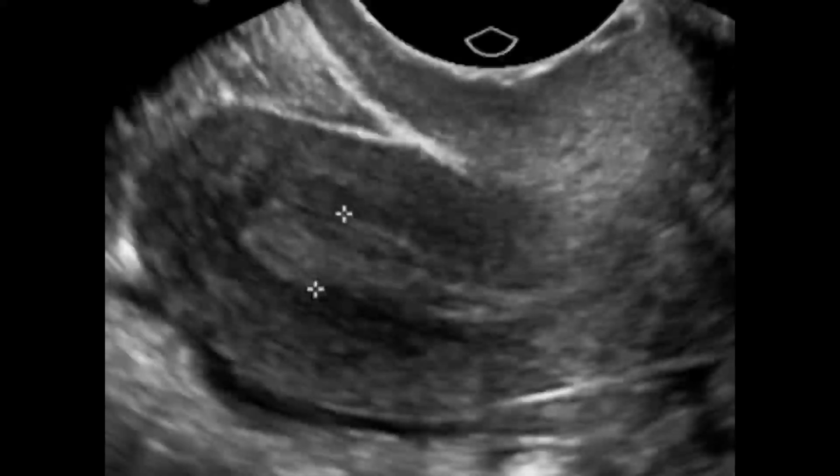This is a clear view of the transvaginal scan, and you can appreciate that the endometrium is thick. The myometrium is quite normal, endometrial thickening is there. You know that the endometrial thickness varies according to the phases. In the proliferative phase it should be between 5 to 10 mm, and in the secretory phase it will still proliferate due to glandular activity, and in the menstrual phase it is likely to shed around that time.